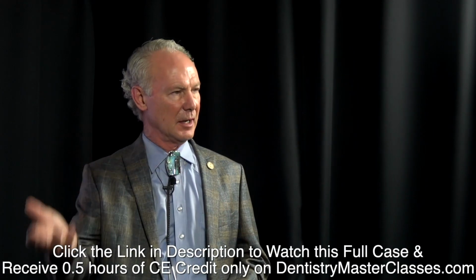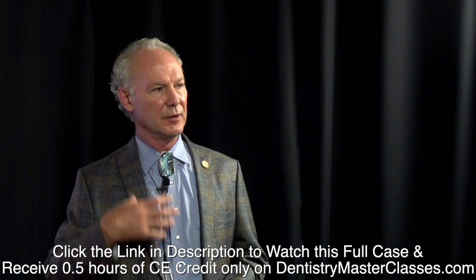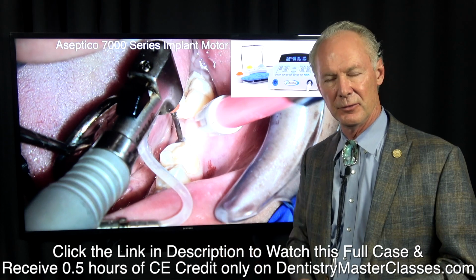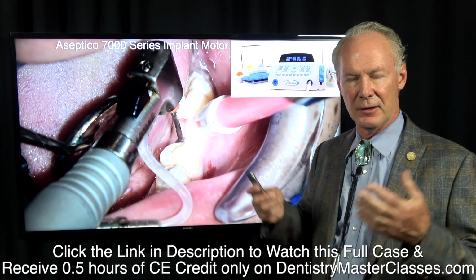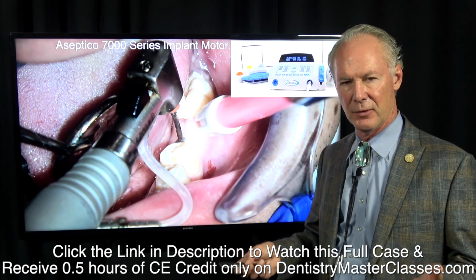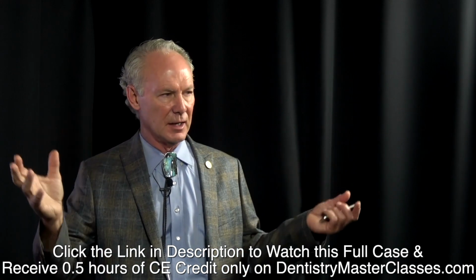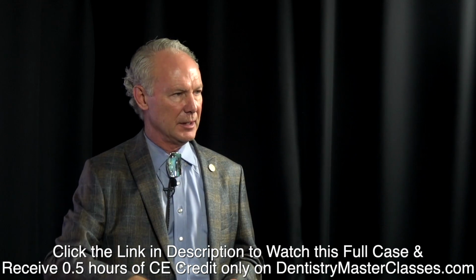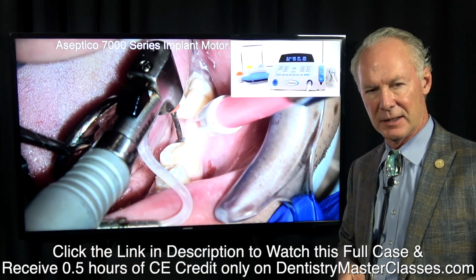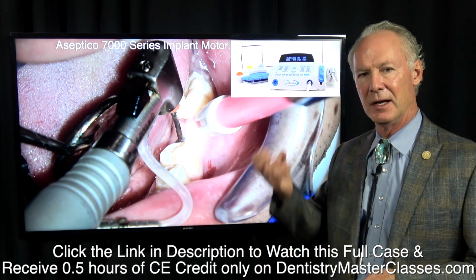If you read the articles that I have in the library of dentistrymasterclasses.com, there's no real issue with perforating the floor of the maxillary sinus. The problem with perforating the floor of the maxillary sinus is if the implant is in the sinus, it's not in bone, it's just in space. So you want the implant to be in bone.